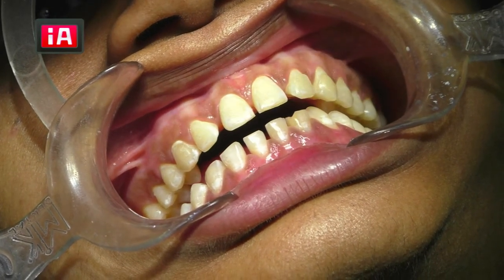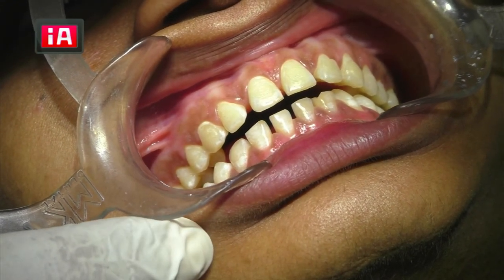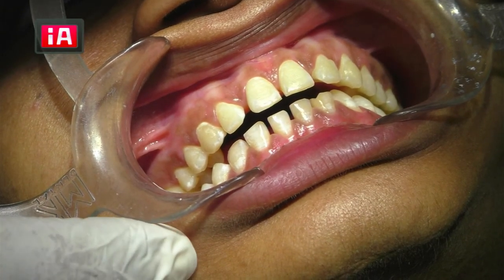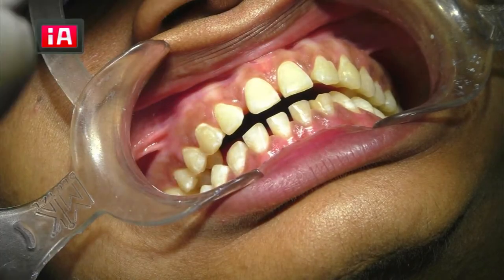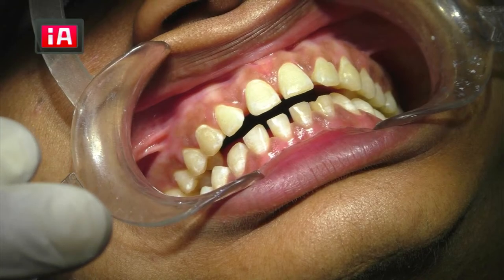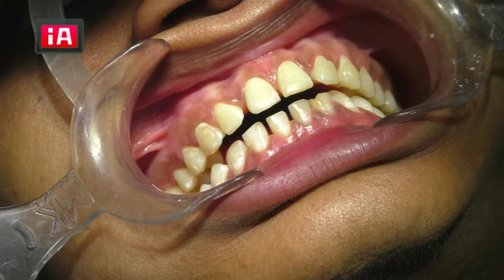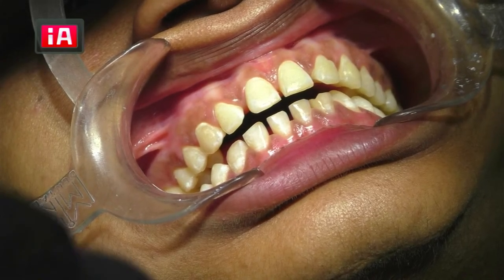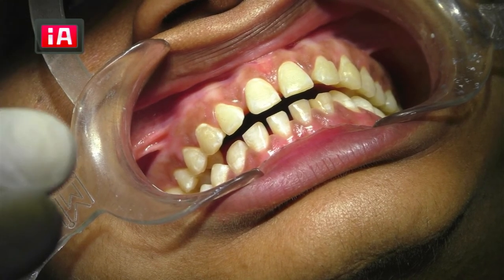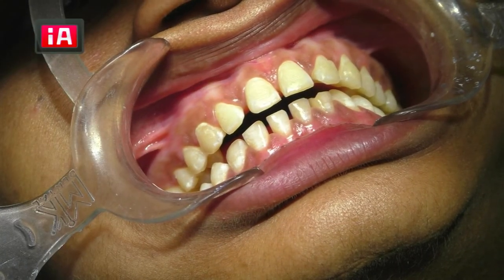So today we are going to do the veneer preparation for the anterior teeth. First, there are two terms: veneer and laminate. Technically both are almost similar, and preparation-wise also both are similar. The only difference is that with a veneer, if you want to change the color of the tooth, you require more preparation. With a laminate, you're not changing the color. You're just giving a layer on top of it, so the tooth looks more beautiful.